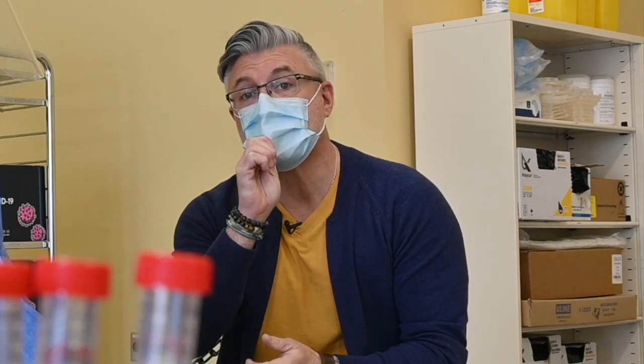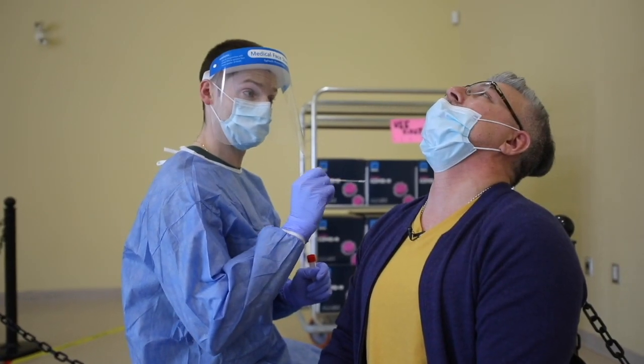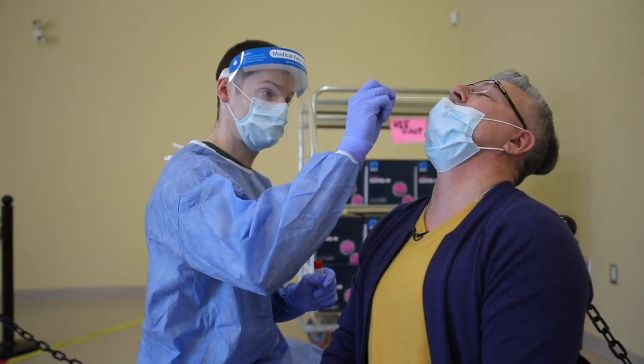Depending on which location you actually get your test done at will depend on what type of rapid test you receive. Generally speaking, in the urban settings like Big Calgary and Big Edmonton, you're going to require a nasal swab to work with the type of rapid test they use, whereas other sites, like more rural and suburban areas, you'll require a throat swab to work with the equipment that they use. Okay, so stay nice and still for me and start taking a breath in through your nose.